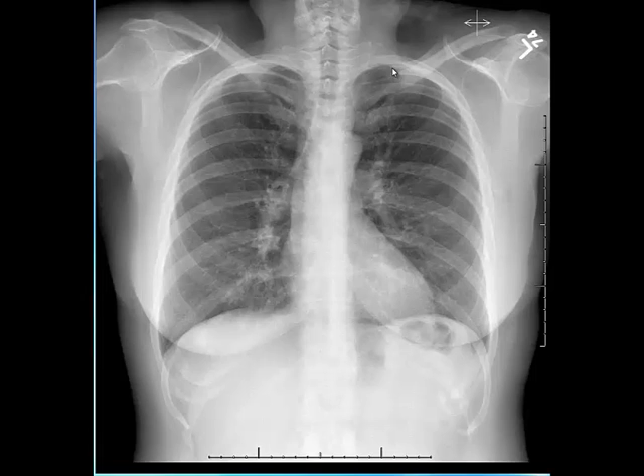Last but not least, I evaluate the osseous structures and soft tissues. I systematically assess all the bones including the clavicles, ribs, humeri, proximal humeri, and scapulae, as well as the soft tissues including the soft tissues of the lower neck, the anterior and lateral chest wall, and the upper abdomen for any pathology.